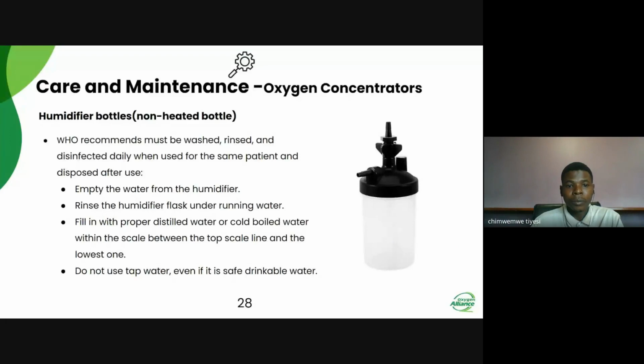Next. The World Health Organization recommends that the oxygen concentrator humidifier must be washed, rinsed, and disinfected daily when used on the same patient and disposed of thereafter. The World Health Organization regards this humidifier bottle as a use-once type of medical oxygen accessory.